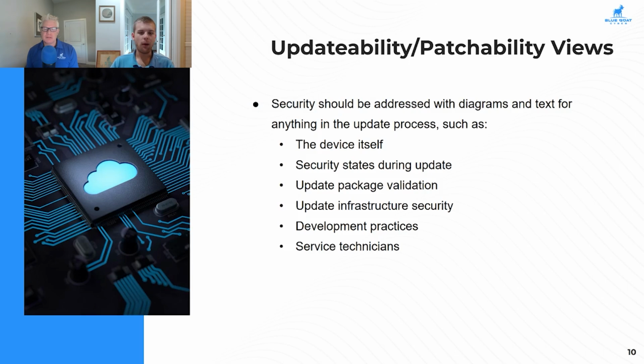How are we validating an update package is intact and secure? How are we securing that infrastructure? You can even go all the way down to the human level. What development practices should you adhere to make sure that you're designing good code, you aren't designing risk into the device through the update practices, and you don't have any malicious insiders? How can you verify that your service technicians rolling out updates are addressing security? They aren't leaving their laptops unlocked and these USB keys out in the open while they go to the bathroom or go get some water or something like that.